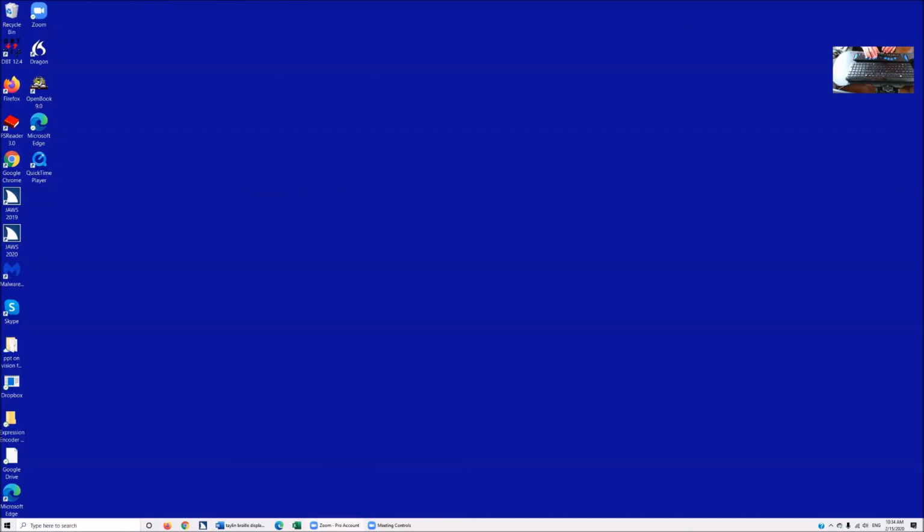Okay, so now let's go ahead and move into the internet, and let me show you actually how to find any lesson that you want in order to teach anything. And that's going to be the TechVision site. So let's go ahead and we're going to do Windows 2 to open Chrome and then go to the TechVision site.